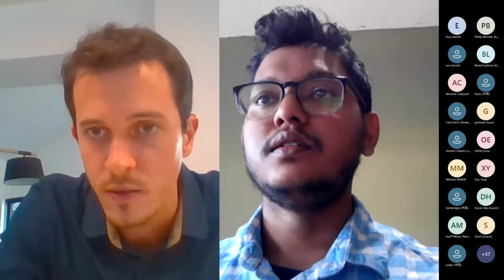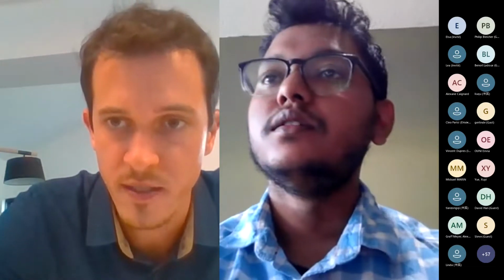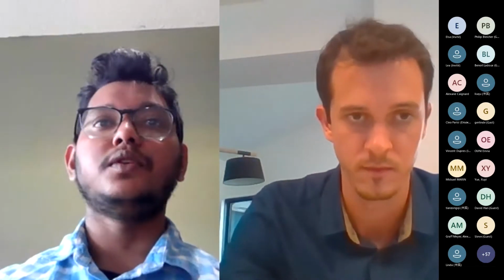Okay. So we have a question from Kazi. Very nice presentation. How do you apply PLL to the PDMS surface, as normally PLL does not adsorb to untreated PDMS? Oh, actually it works for us because we were following the exact protocol from Alvéole, and we did just the PLL treatment for 1 hour on our PDMS substrates. So it did work for us. It's been working really fine.